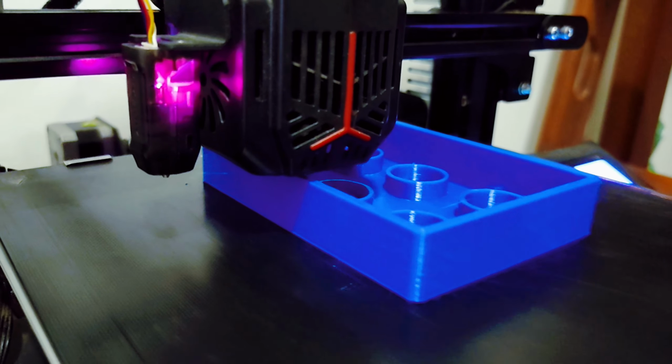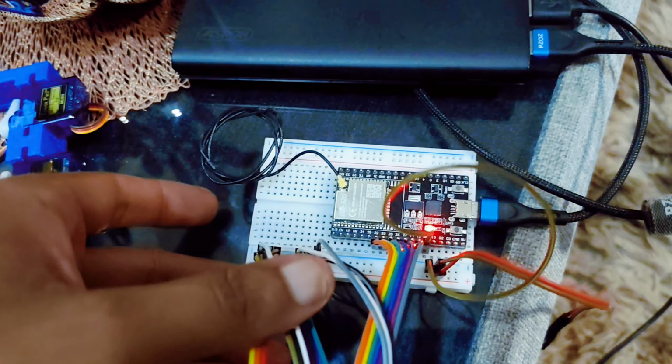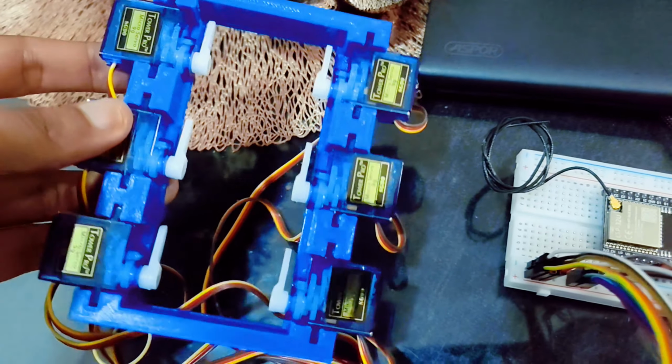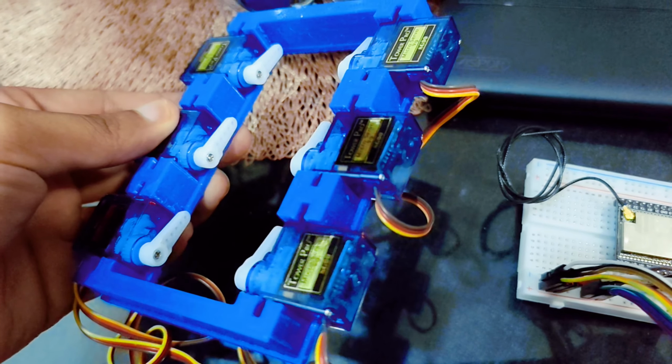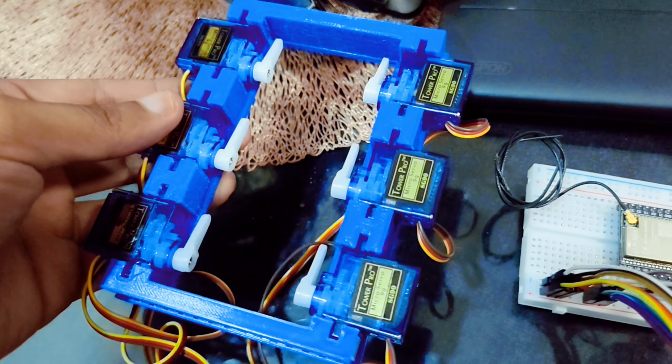A visually impaired user could point the phone camera at a document, sign, label, or object, press one button, and receive the information through a compact, tactile braille device. The final product could provide a practical and portable way for visually impaired people to access visual information independently.